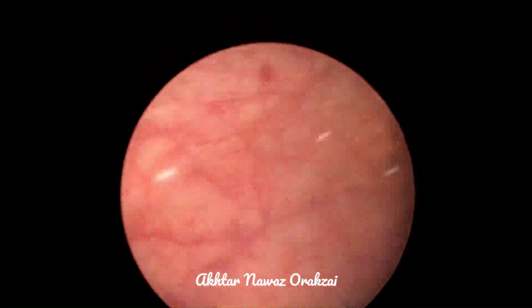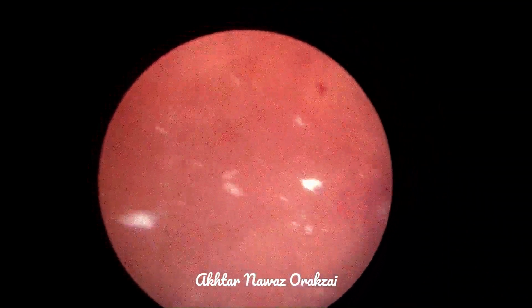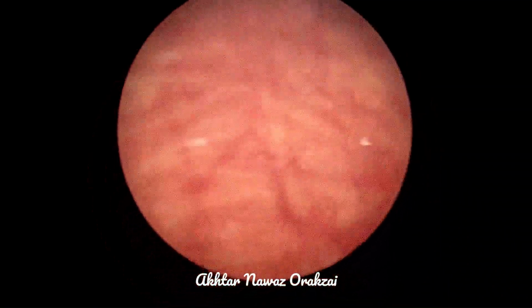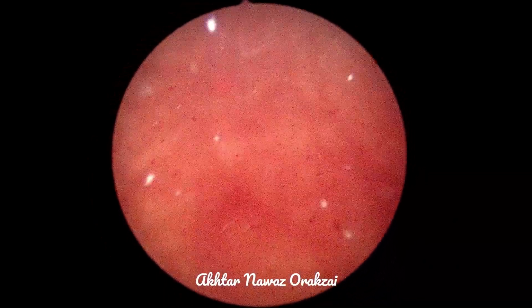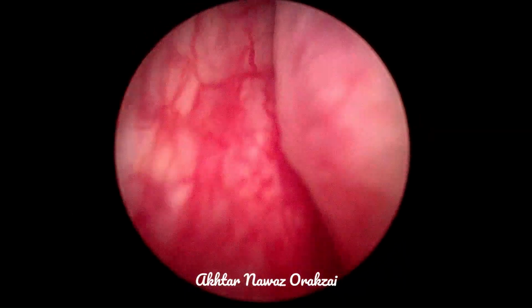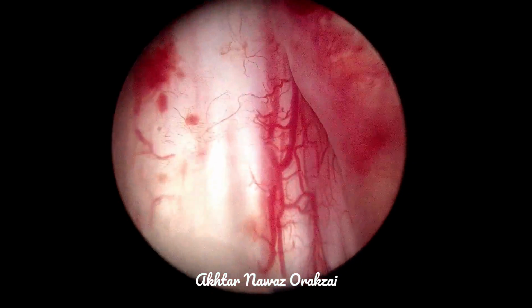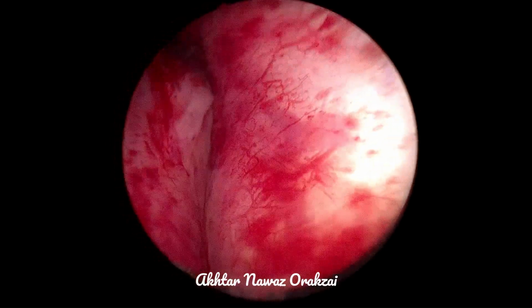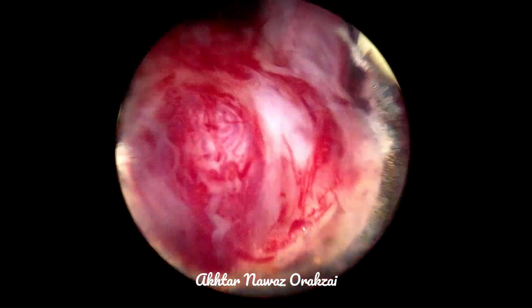On general cystoscopy, we can see that there is a lot of inflammation around the bladder, but there is no evidence of any bladder growth. So this shows clear-cut obstruction of the bladder outlet. So we decided to perform transurethral resection. This is the median lobe here. You saw the bladder neck.